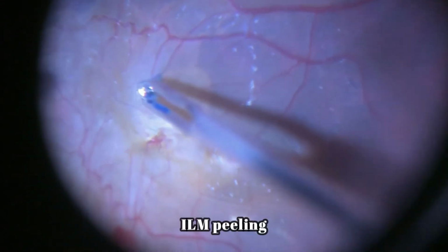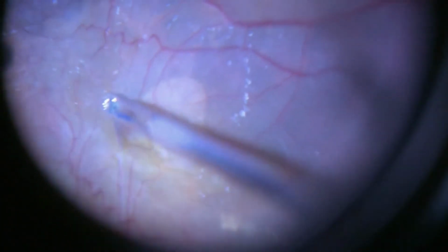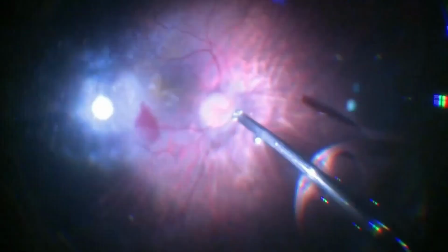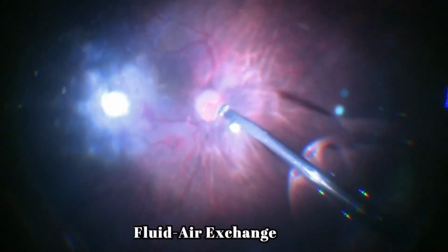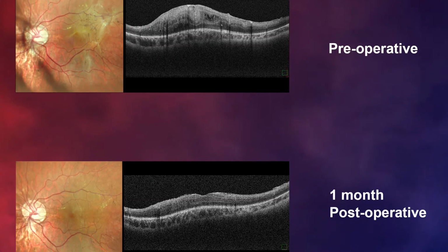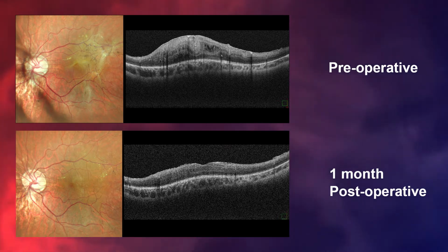This was followed by internal limiting membrane peeling. Fluid air exchange was done at the end of the surgery. The 1 month post-operative optical coherence tomography showed a completely removed membrane, leading to a normal foveal contour.